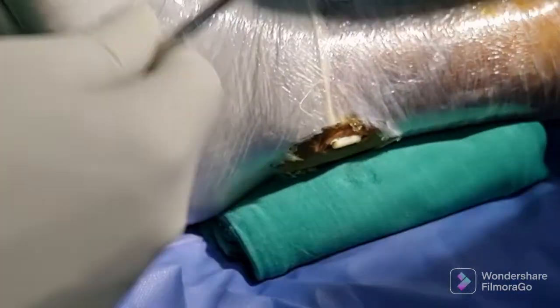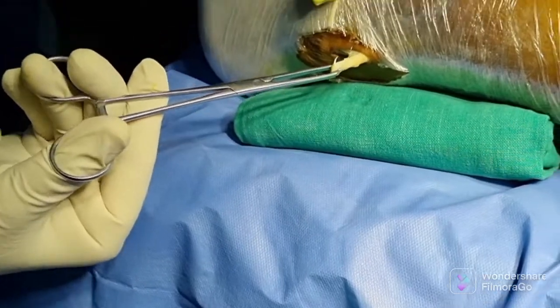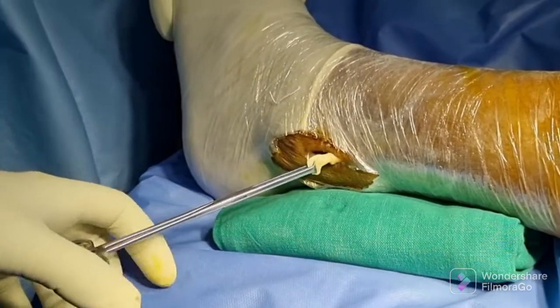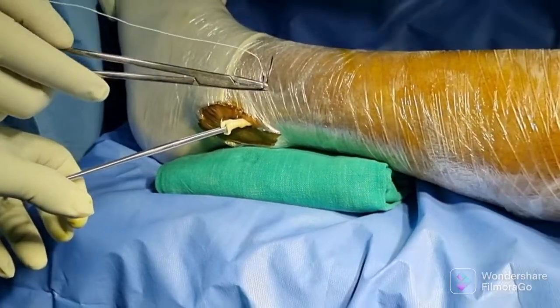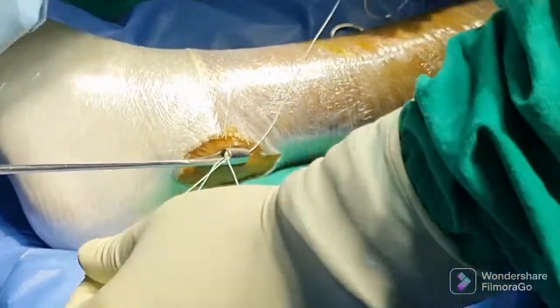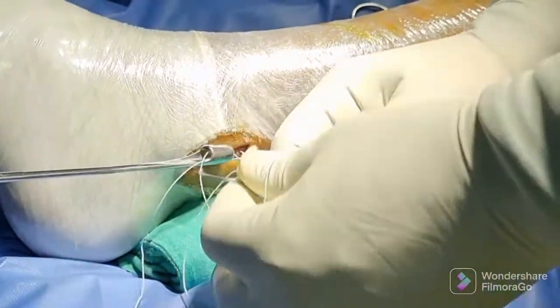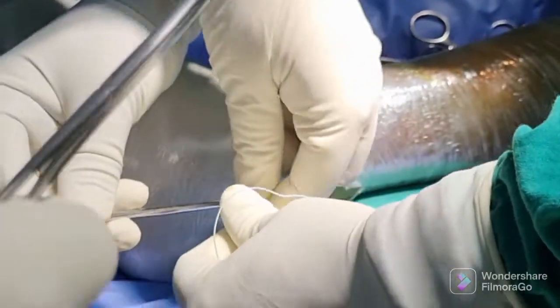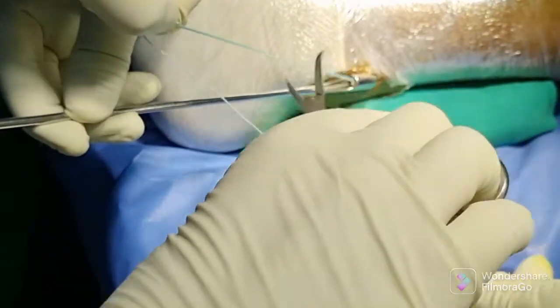Grasp the lower two-third part of the tendon with the help of an Allis forceps. Now use four to five whip stitches in order to secure the tendon, then pass a 6 mm closed tendon stripper to harvest the tendon.